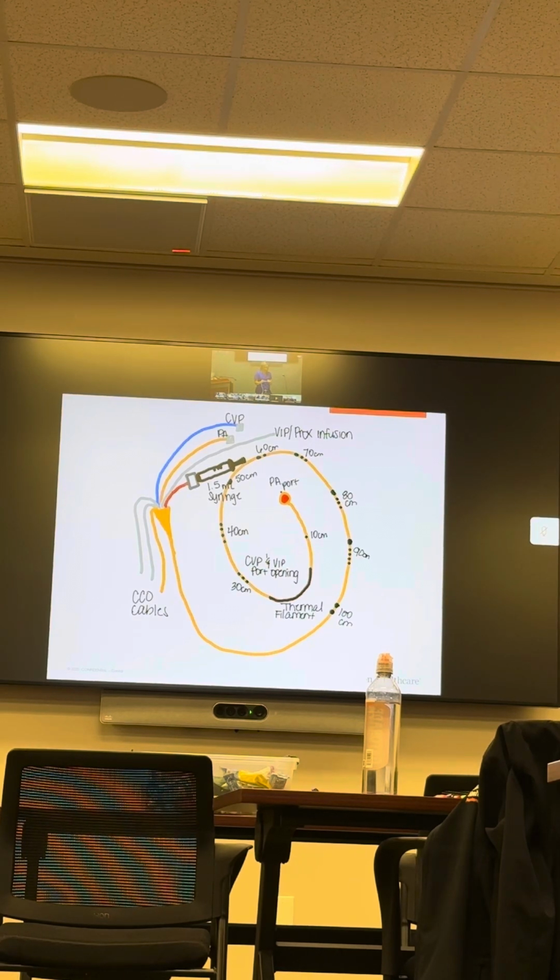So right here, I see one thick, one little line. That is, I am staring at the number 60. And I know zero's over here. So, zero's inside the patient. I'll say this is 54, 55. Alright? But if Ben says, it was 62 earlier, that's different. If Ben says, I put it at 54, and I say it's at 55, no. Right? It is an estimate, but you do need to get comfortable with this.